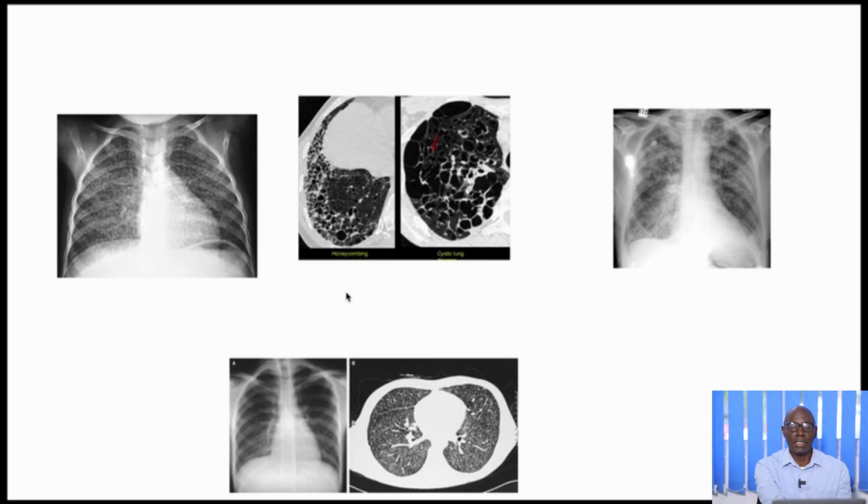So that in a nutshell covers our lung, and I have said that in the lung there are two main structures, that's the alveolar and the connective tissue, that is the interstitium. As one is looking at an X-ray, it's very important to appreciate that the alveolar is filled with air. When the air is replaced, then you have the whiteness or the opacity, and those are referred to as alveolar in nature, and the distribution gives it away.